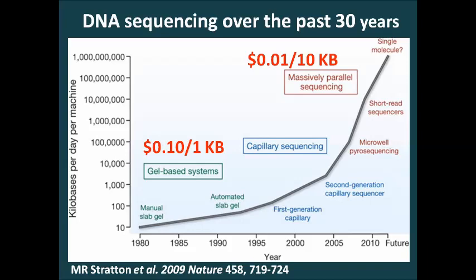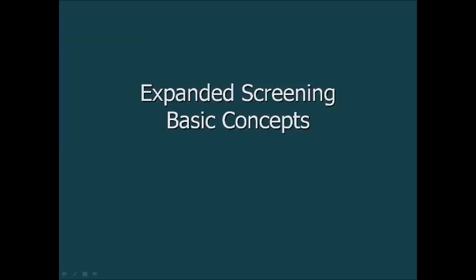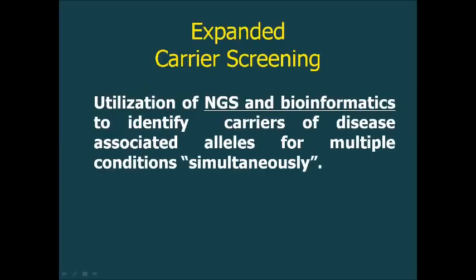The term deep sequencing refers to the ability to perform repetitive sequencing runs at low cost over short time periods in an effort to improve fidelity. I want to use expanded carrier screening as our launching point here to understand some very basic concepts in screening.